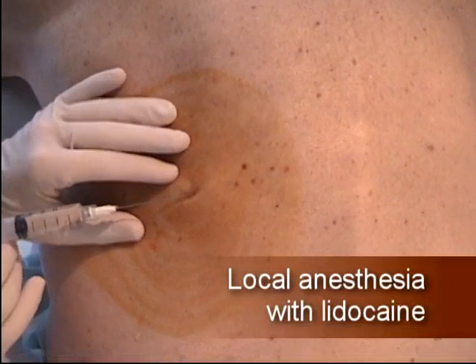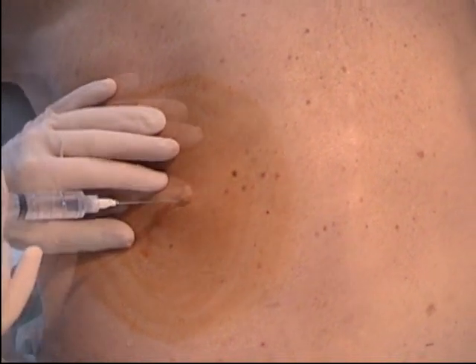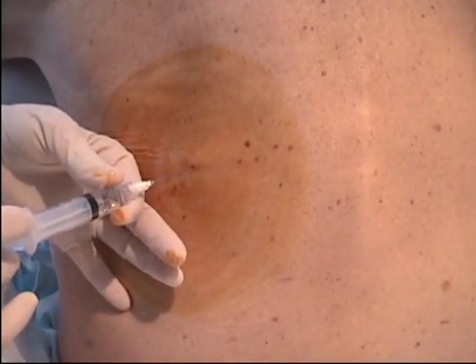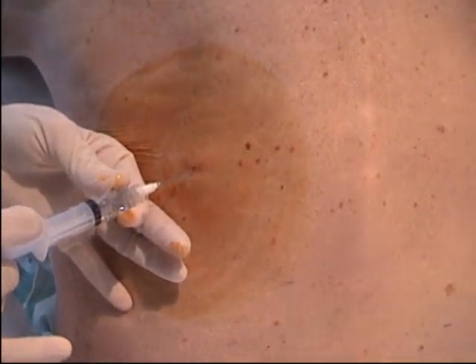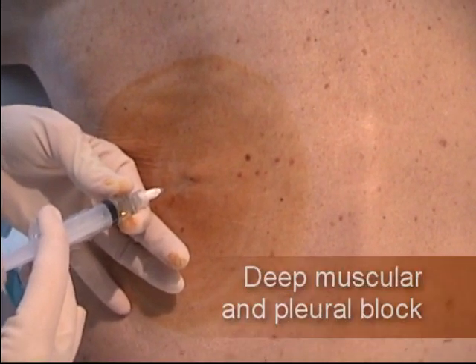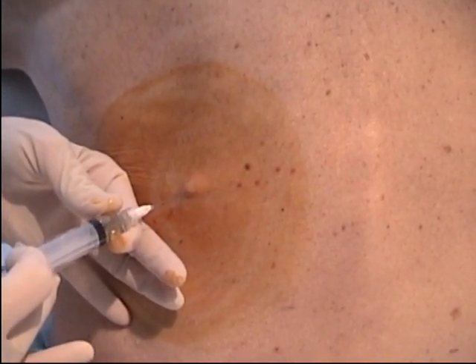After creating a superficial wheal, pass the needle deep into the intercostal muscle and inject 1 cc. Advance the needle 1 centimeter at a time, injecting 1 cc of anesthetic each time to anesthetize the deep layers superficial to the pleura. Apply negative pressure to the syringe while advancing it. You can usually feel a palpable pop when penetrating the tough, fibrous pleura.